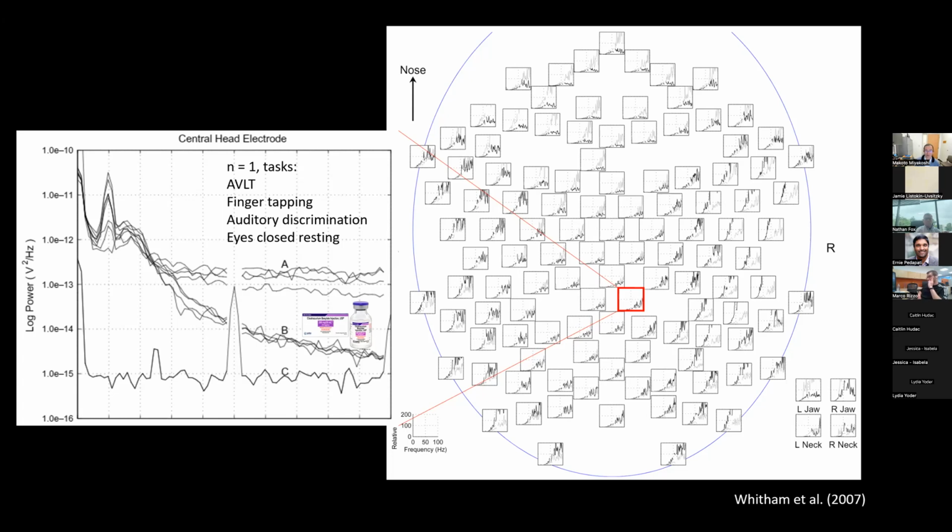we think we can analyze the beta gamma range, but this is kind of the ground truth of how much muscle contribution is still there when we analyze beta and gamma. And in the right plot, you see the exponentially rising traces, and this is basically the difference between with and without using the anesthesia when doing the same task. So basically this is the amount of the contribution by muscle, right? And it's exponentially increasing towards the higher frequencies.